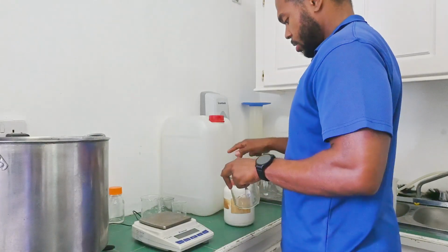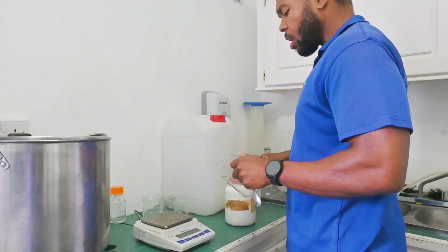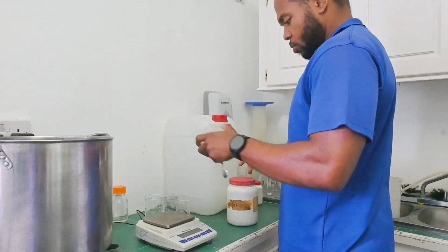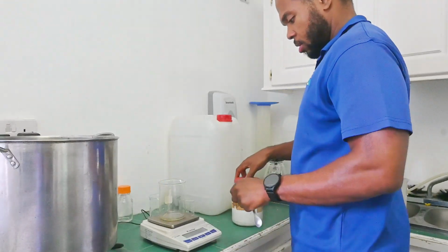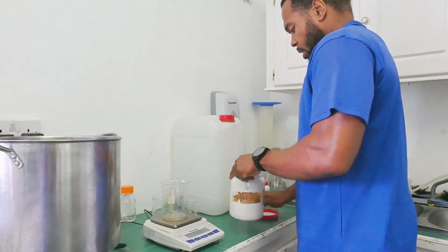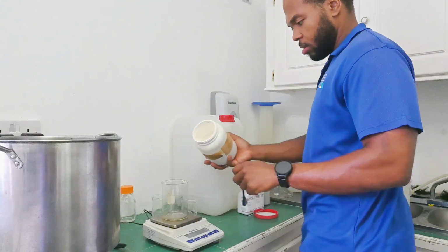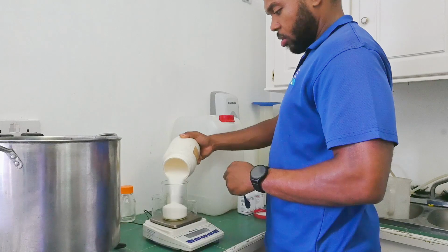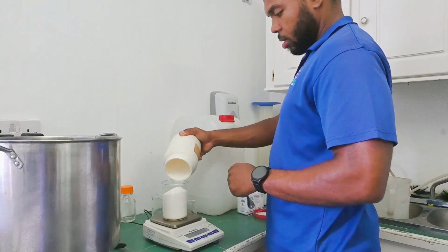The next one we're going to add is sugar. You can use glucose, but it's cheaper to use sucrose, so we use normal table white sugar. That will be the energy source for the plant that it breaks down in its processes. So you're going to add 30 grams per liter, so a total of 480 grams of sugar needs to be weighed.